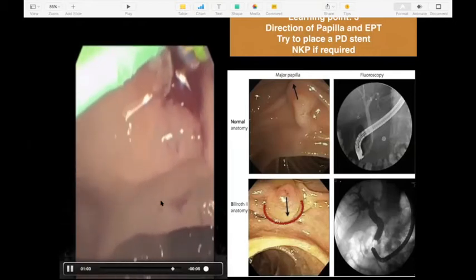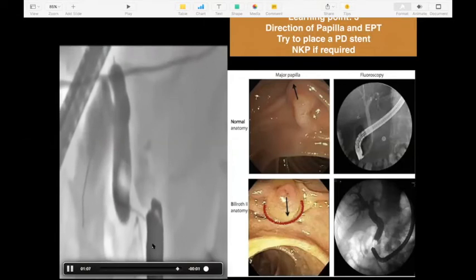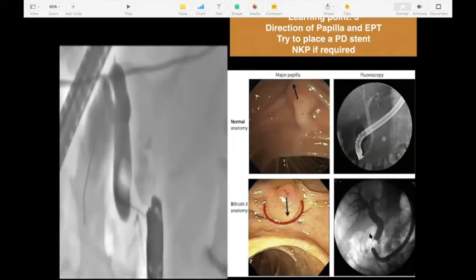You can see here in the video that it will show a cholangiogram also where the scope is rotated. You see it's always done in a long loop, and the position of the bile duct is not similar to what we see in a normal ERCP. This is a similar cholangiogram in a patient who had a Billroth 2. You see the position of the scope. The scope is rotated and twisted. So either it will come at the 6 o'clock position, or if we come into the normal position, then it will be showing in the opposite direction.